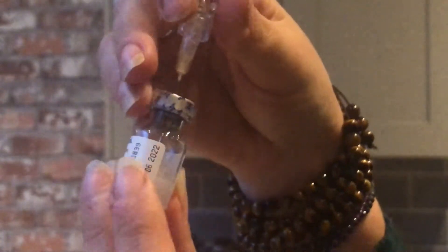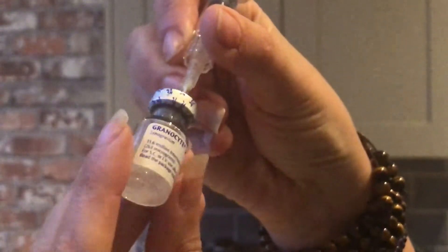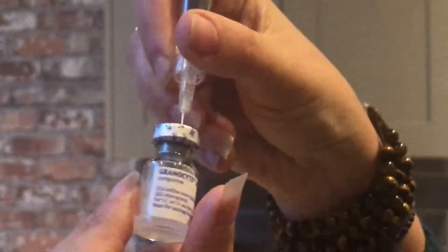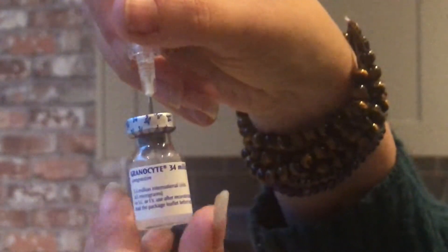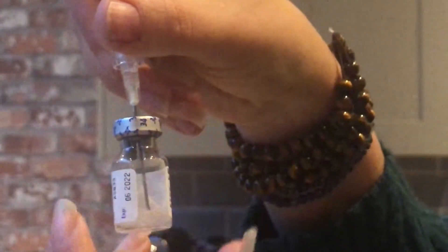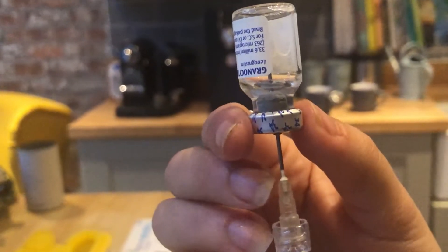You can see the solution is in the bottom. So you want to then spend a minute just twisting — not shaking, because you don't want to get air bubbles — twisting the solution in the bottom until you can see that all of the powder has dissolved. You normally spend about a minute twisting this. So now the solution is mixed in both bottles.